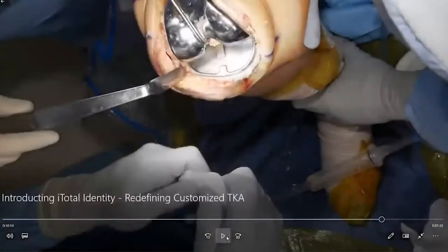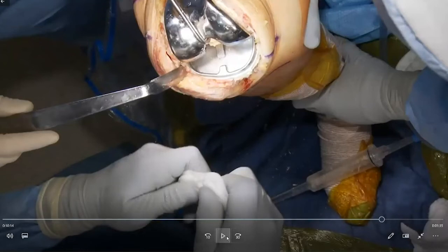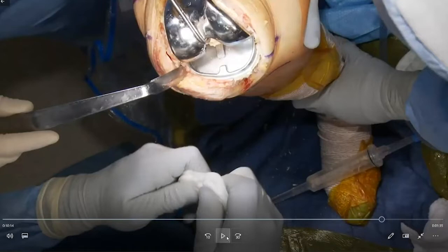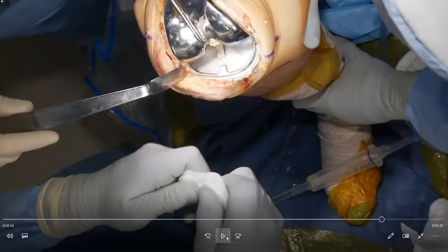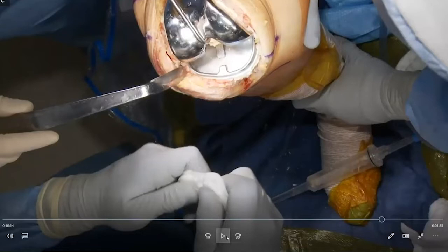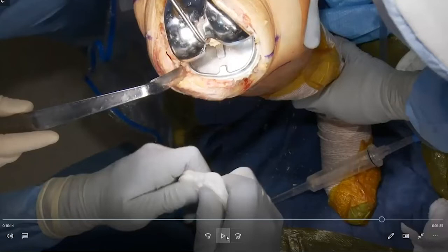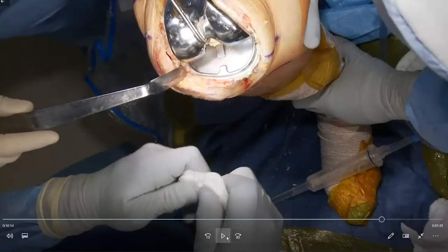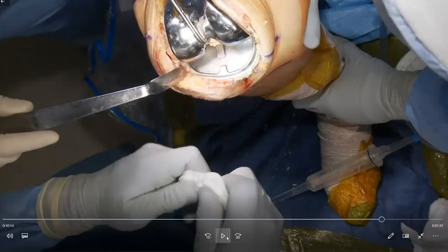Regarding stem extensions: through that tower, you would drill even farther down according to whether you want a 20 or 40 millimeter stem, and there's an adapter in the system that allows you to do that. You'd then select a stem according to personal preference and how you feel they enhance stability. For the drilling, it's approximately a 15 millimeter boss stem drill, and then a 13 millimeter stem drill distally where the stem extension goes. The stem is 12 millimeters in diameter, so you'll have a 0.5 millimeter cement mantle around the distal tip of the stem.